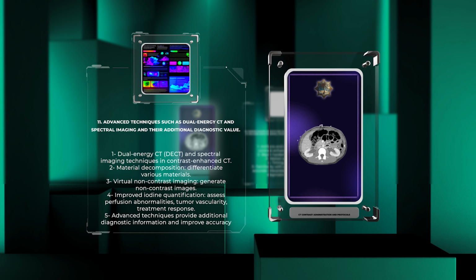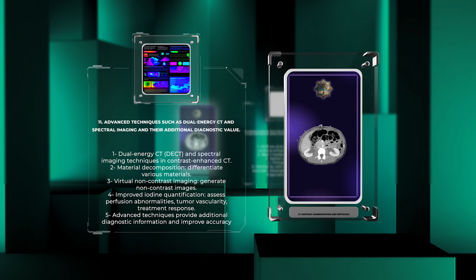3. Improved iodine quantification. Both DECT and spectral imaging techniques provide the capability to quantify iodine uptake, assisting in the evaluation of perfusion abnormalities, tumor vascularity, and potential treatment response assessment. Though these advanced techniques require specific hardware and software capabilities, they offer valuable additional information, improving the diagnostic accuracy and expanding the clinical utility of contrast-enhanced CT imaging.